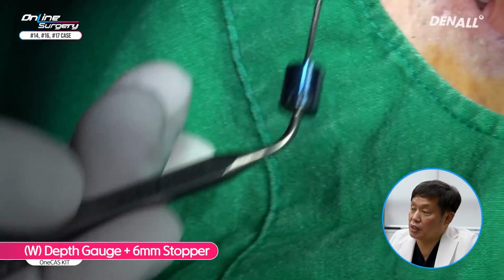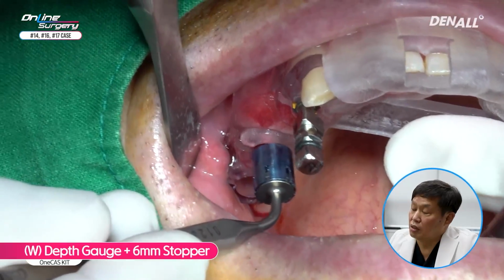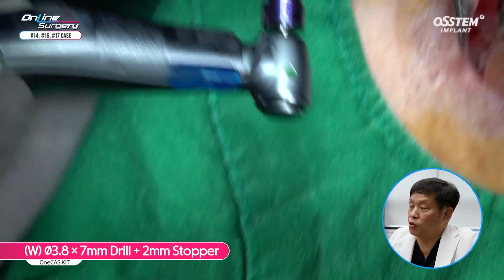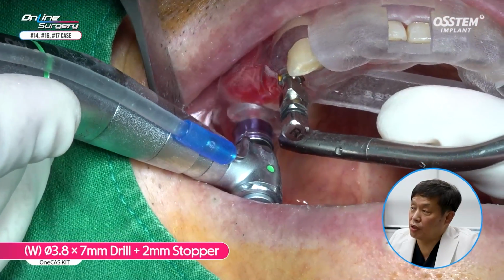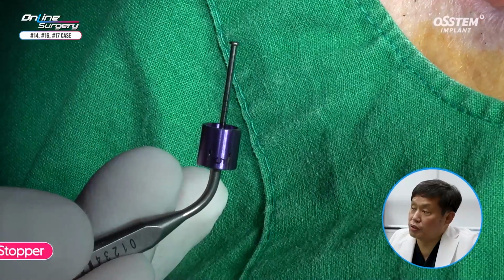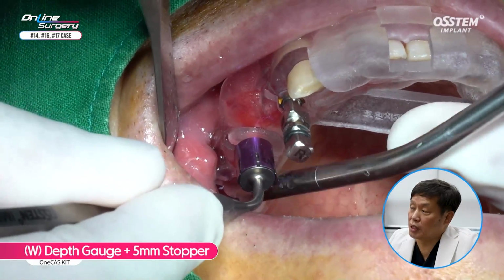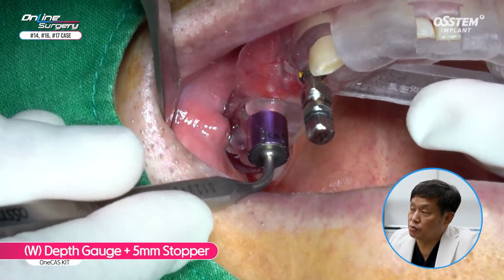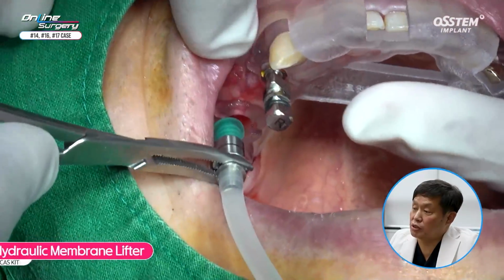6 millimeter stopper was added to depth gauge, and you can see that the sinus floor was not penetrated, so there's no contact. After that, 2 millimeter stopper was used, so drilling was done up to 5 millimeters. So I felt a sense of penetration here, and a 5 millimeter stopper was added, and using depth gauge, you can see that stopper is in contact with the template. So the sinus floor was penetrated here.